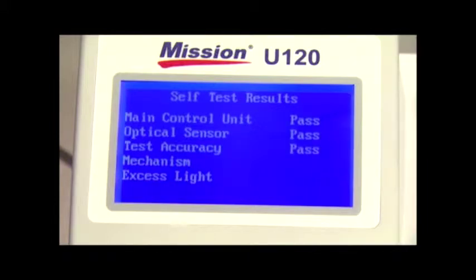A results screen will display the result of each test. After each test, a pass or fail is displayed on the screen.